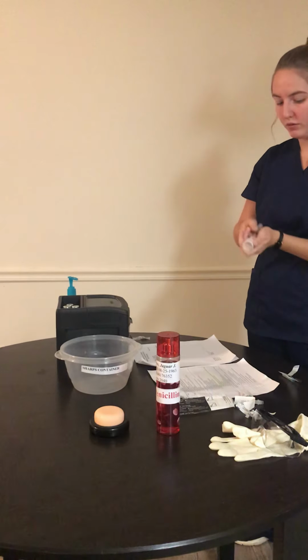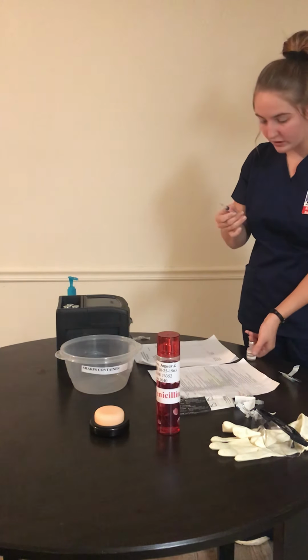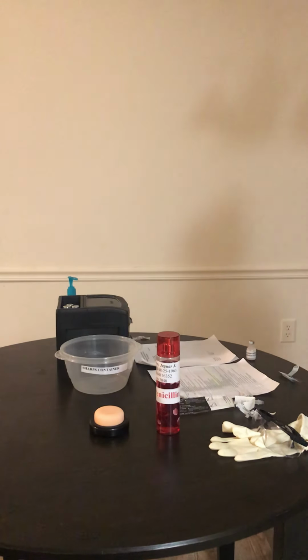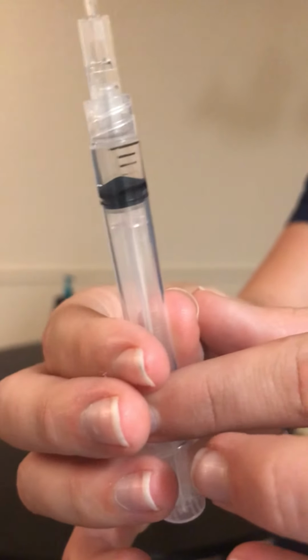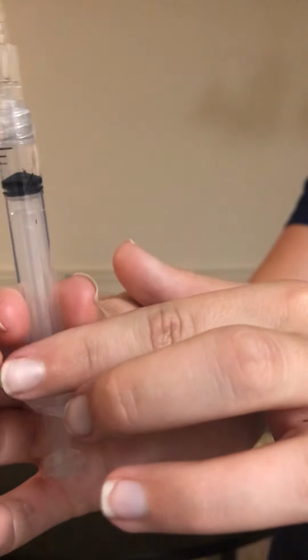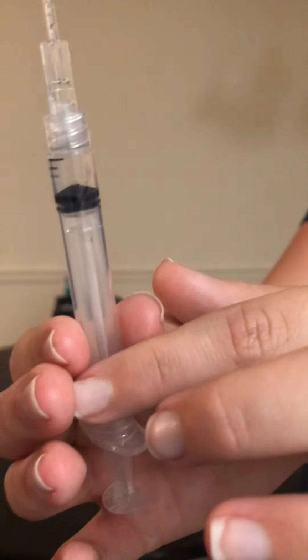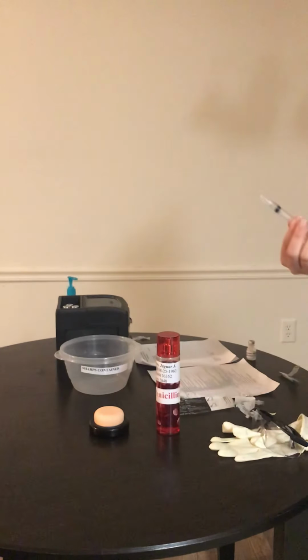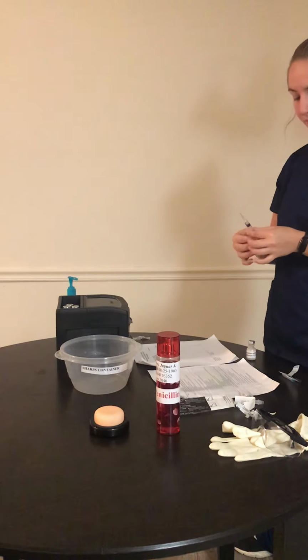Once I have removed all big bubbles, I'm going to show that I have half a milliliter of solution. All of my numbers rubbed off, so I just wrote where the 1/2 was. And I have half a milliliter of morphine sulfate. And that is the correct amount.